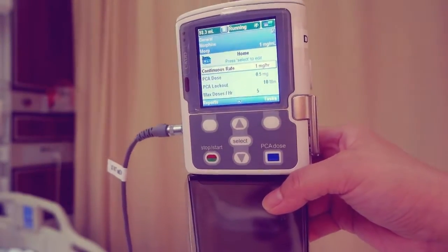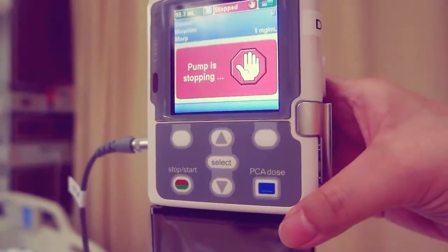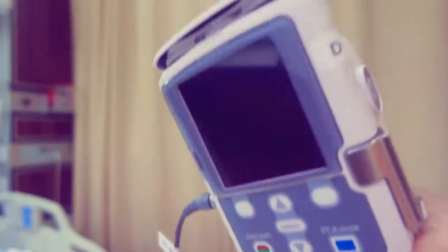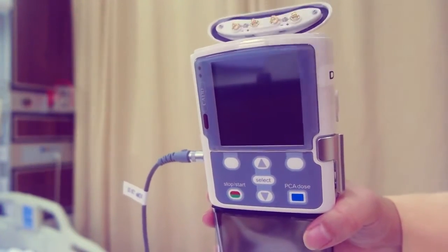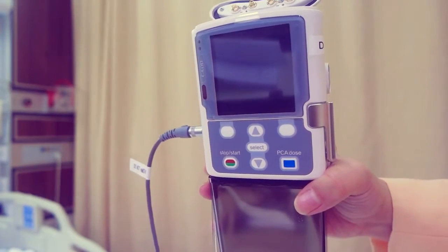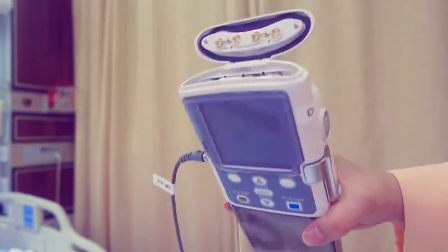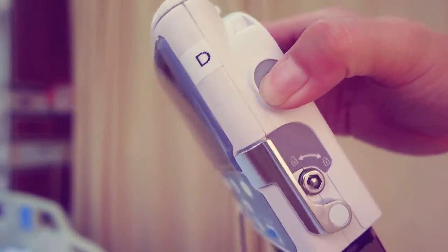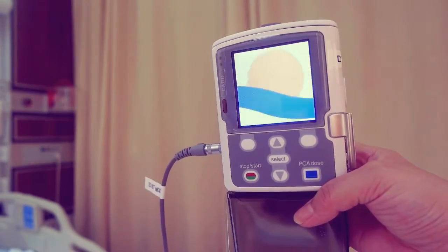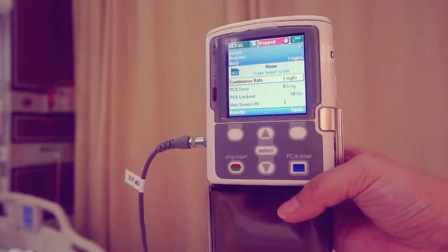Stop the pump when changing the battery. Stop pump displays — press yes. Remove the used batteries and insert the new batteries. Press the power switch to turn the pump on. The screen displays: do you want to start a new patient? Press no, then start the pump.